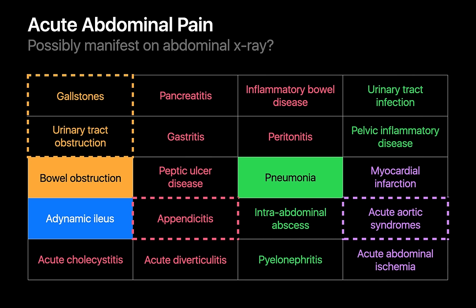When we read abdominal films for a patient with acute abdominal pain, we have a realistic opportunity to identify a bowel obstruction, adynamic ileus, or basilar pneumonia. Although abdominal x-rays will be much less sensitive and specific for diagnosing gallstones, urinary tract obstruction, appendicitis, and acute aortic syndromes, they can provide some of the evidence used to build a case for the workup and diagnosis of these conditions.